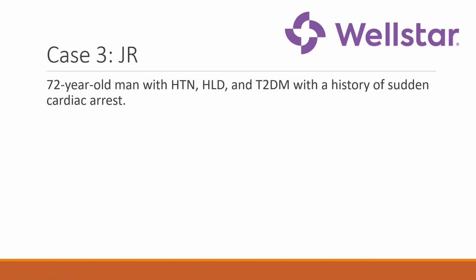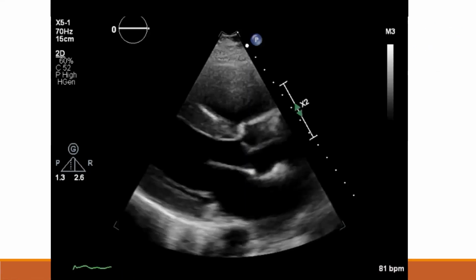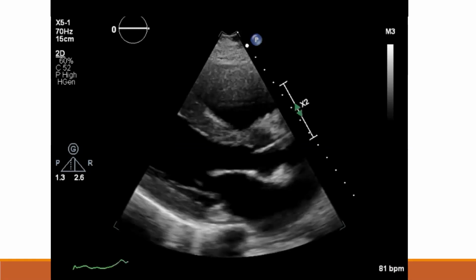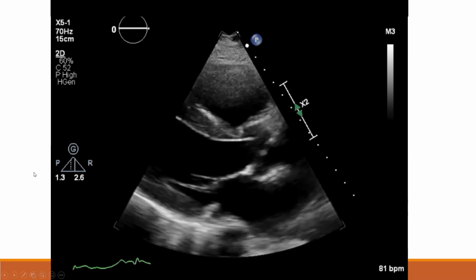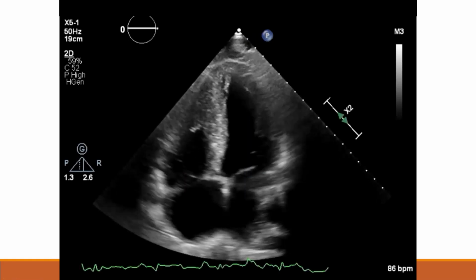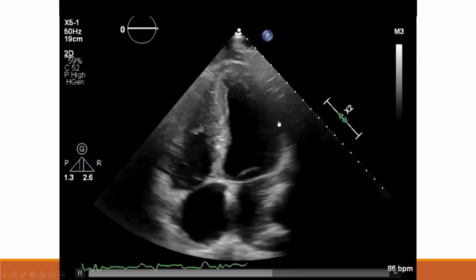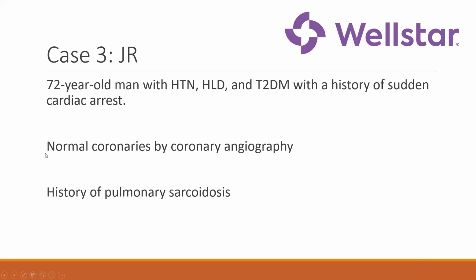All right, moving on to our third case. This is a 72-year-old man with hypertension, hyperlipidemia, and type 2 diabetes who also had a history of sudden cardiac death. Obviously, he survived, but here's his echocardiogram, and you can see this patient doesn't have any hypertrophy, but the LV systolic function is reduced. Here's his apical 4 chamber, maybe a little bit of hypertrophy, but overall, the main finding here is that LV systolic function is reduced.